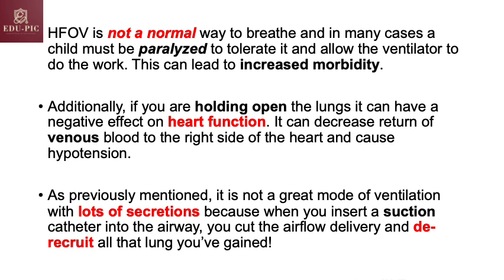As previously mentioned, it's not a great mode of ventilation with lots of secretions, because when you insert a suction catheter into the airway, you cut airflow and de-recruit all that lung you have gained.